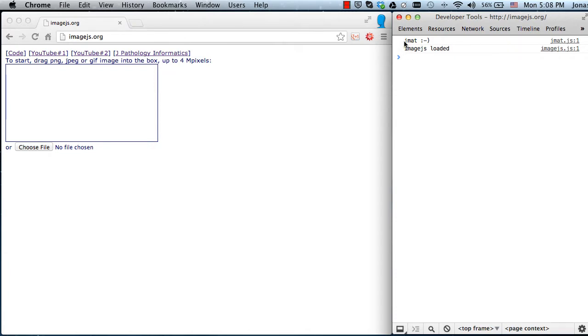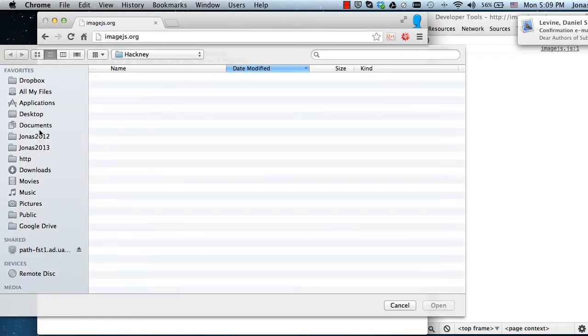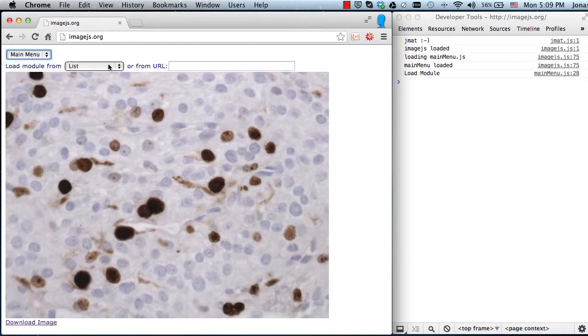Today, I hear from Sean, may actually be a bad Google day, so I'm going to try to load it several times to see if I can get an error. Okay, I guess I'm not going to get an error, so let's try a little harder. I'm going to load the image you sent me by email, and now it's loaded. And now I'm going to load the KI67 library. So if some error happens, you'll see it in the console now.